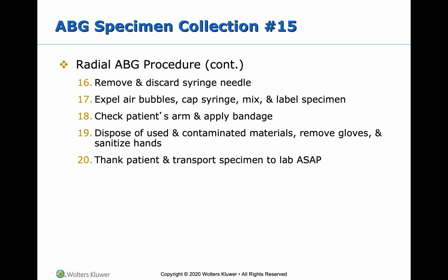and apply a Band-Aid. Dispose of your used and contaminated materials, remove your gloves, sanitize your hands, thank the patient, and transport your specimen to the lab as soon as possible. As I said, you have about a 15-minute window to get it there and put in the system so that the techs can analyze it.